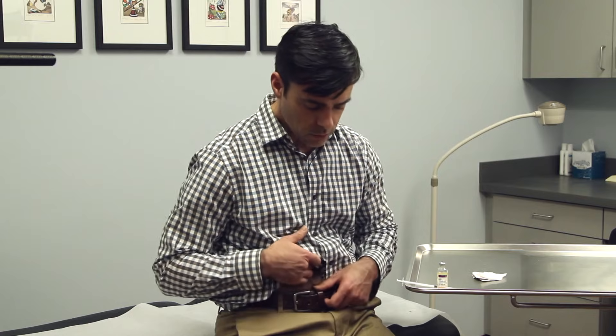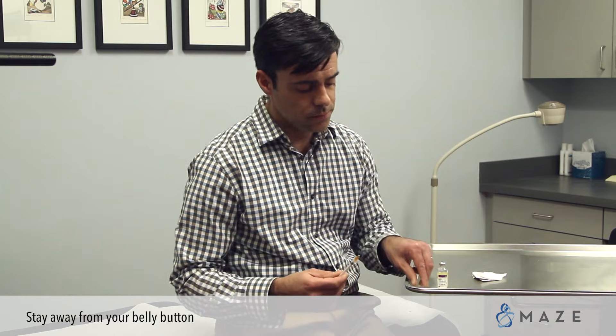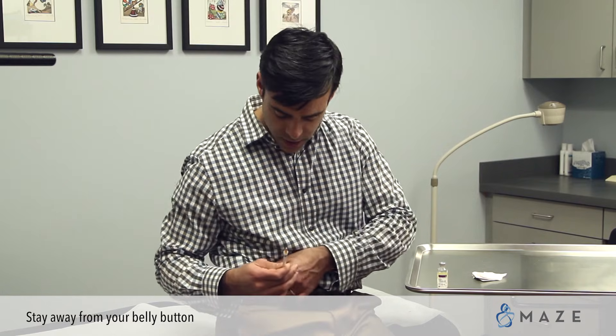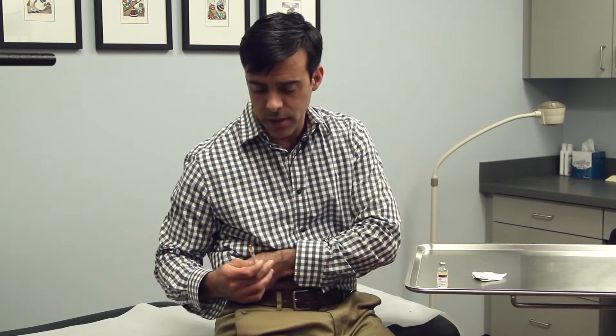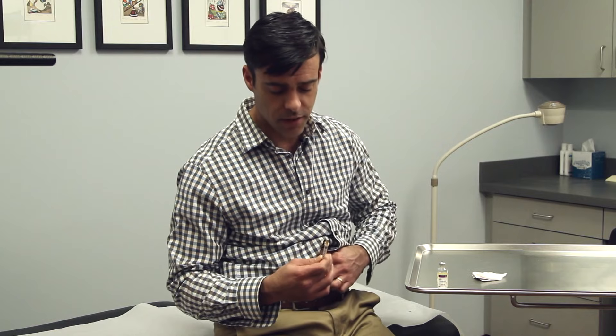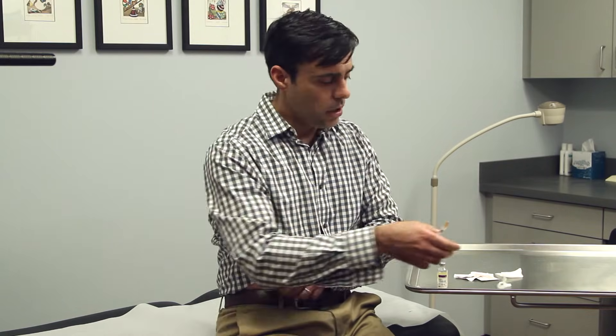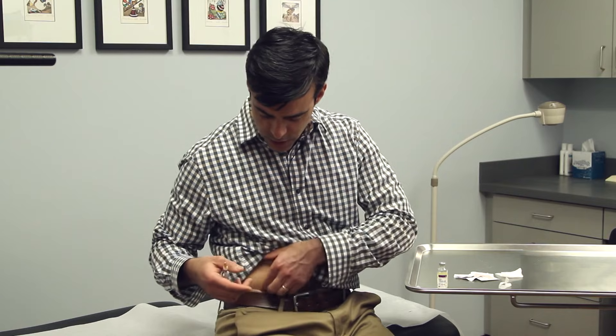To do the injection, you want to focus on the abdomen and stay away from the belly button. The injection is done by pinching the fat layer of the abdomen — you can go anywhere along the side of the abdomen. Cleanse the area you want to inject with some alcohol and get a nice big pinch of fat.